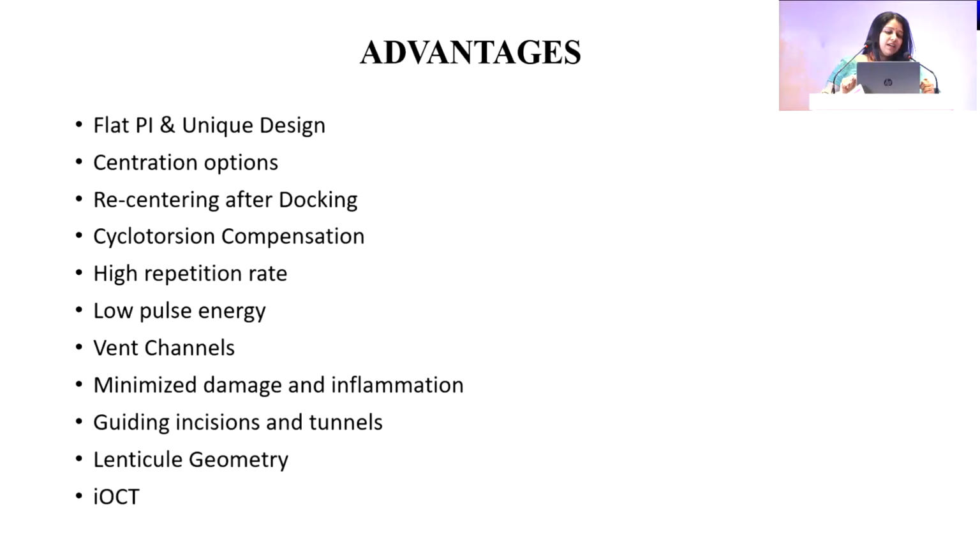That's the best thing. Centration options and recentration after docking without the need to release the suction, cyclotorsion compensation, low pulse energy with high repetition rate, and the vent channels which are formed along with the creation of the anterior and posterior lenticule surface decrease the OBL formation, less ocular damage, and faster visual healing. The guiding incisions and tunnels along with the OCT help us in various ways.